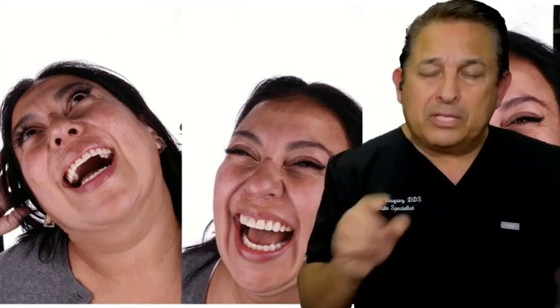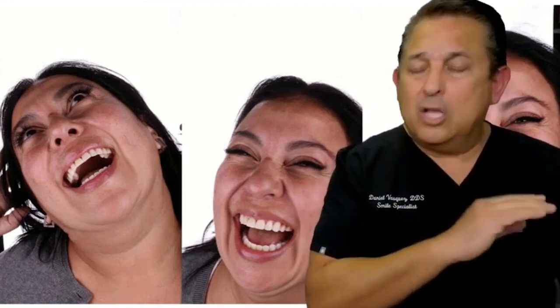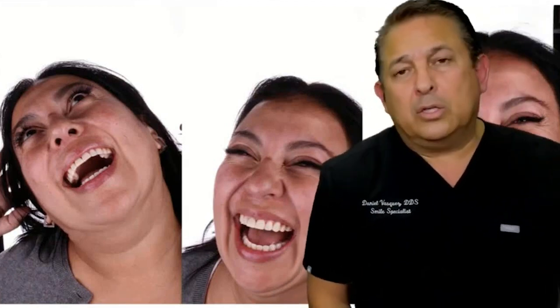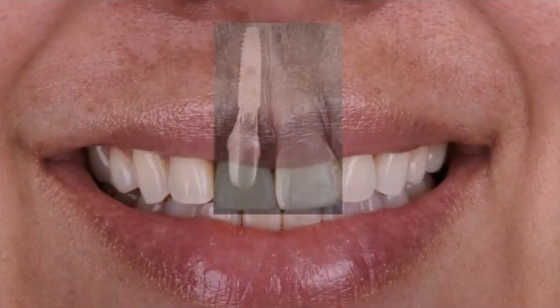Always. No question asked. Patient will have teeth from here to here all the time. From second bicuspid to the posterior, it's implant placement with customized healing abutment. That's what I do. But in the front, it's always going to have a temporary. Look at her smile. Her smile, it's just gorgeous. It's beautiful. Okay? So, having the implant, okay?